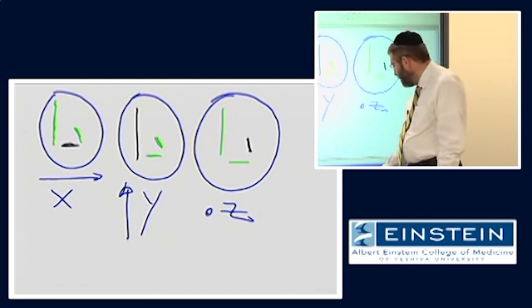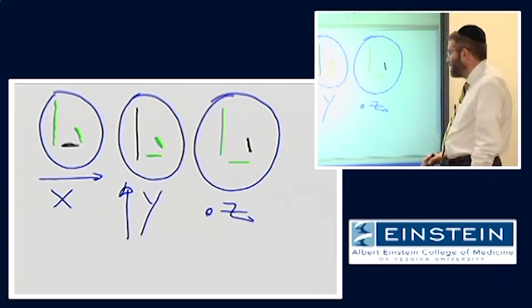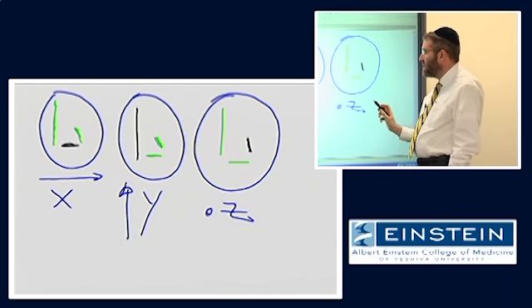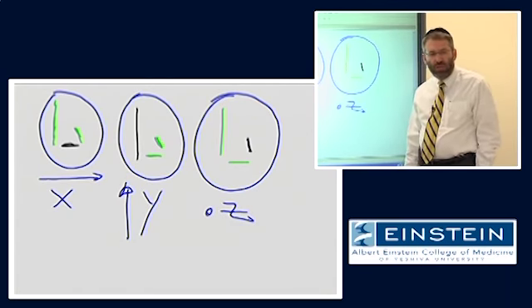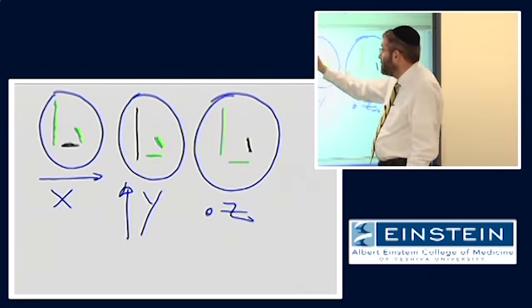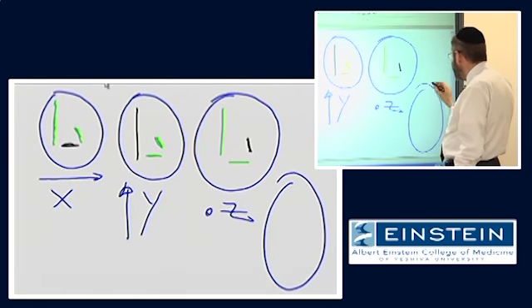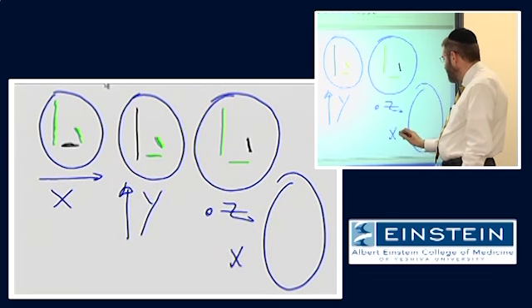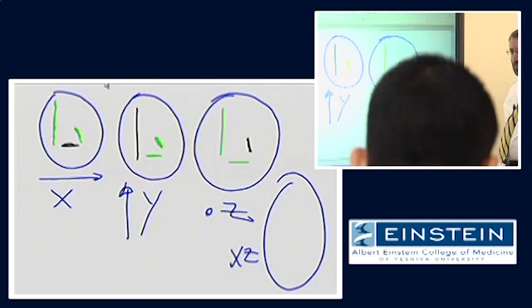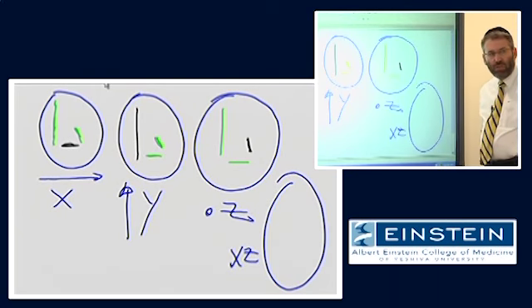Now it turns out that if we have enough of these images, meaning multiple images that are each sensitized to diffusion along a unique direction. So we might have an additional image, for example, which is sensitized along the XZ direction. Okay. And we could have many, many images, each sensitized in a different direction.